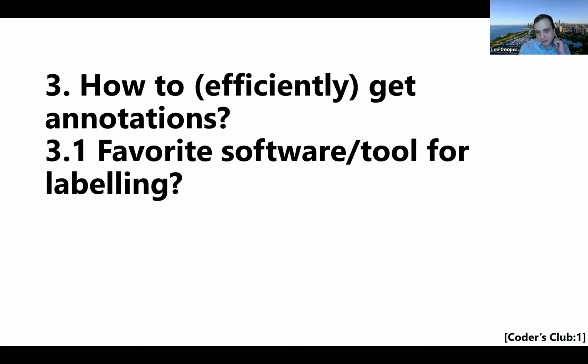I would say, to kick this off, it really depends on where the people are and how much data you have to share and how hard it is to get the annotations back from those people. So, QuPath is obviously a very popular tool. I think that works well if you're close to the person who's doing the annotation and you can share the data with them and it's not too big to move around. Our tool allows centralization, which I think is really powerful when you have large data sets or when you're trying to coordinate the efforts of people all over the world. So I think that local versus hosted approach, those are two very different ways to do this.